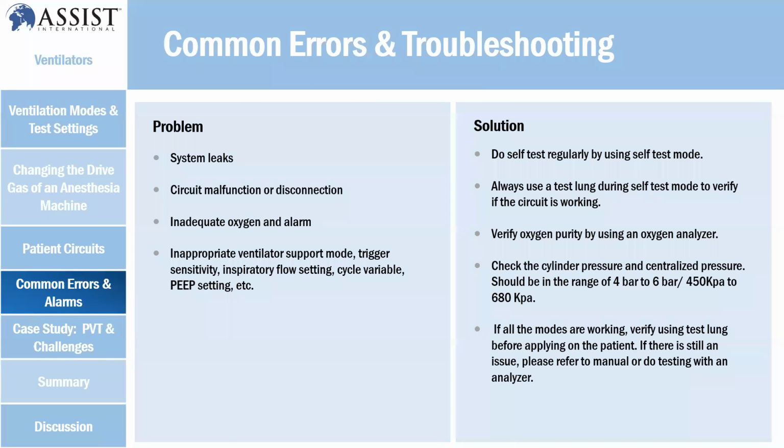So when they use an industrial regulator, they end up using somewhere around 7 bar. Your high pressure regulator is going to make a whistle noise or a high pressure alarm. So you have to be careful with that. You can damage the regulator as well.